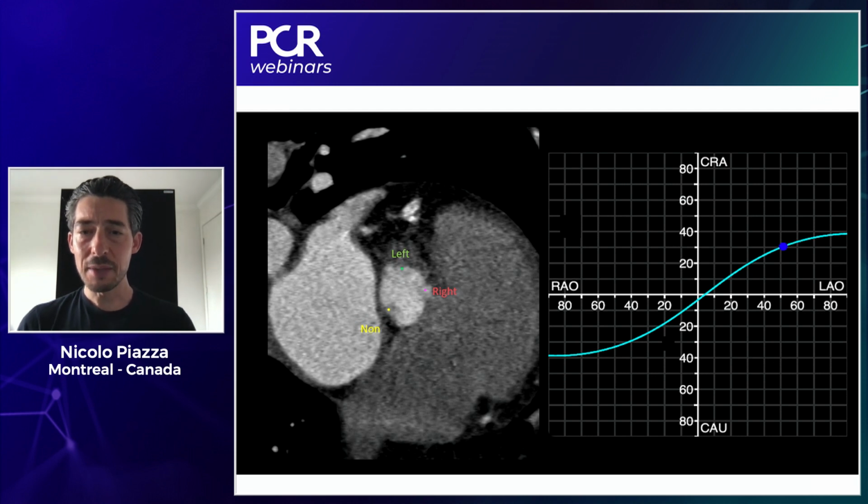Now, this is the aortic valve en face. The non-coronary cusp is highlighted in yellow, the right coronary cusp in red, and the left coronary cusp in green. And depending on how you are visualizing this annulus in plane, you will appreciate the different cusps, whether they are separated or overlap. So let's take this first eye, and you can see that in its field of view, it will isolate the non-coronary cusp, and it will overlap the right and left.